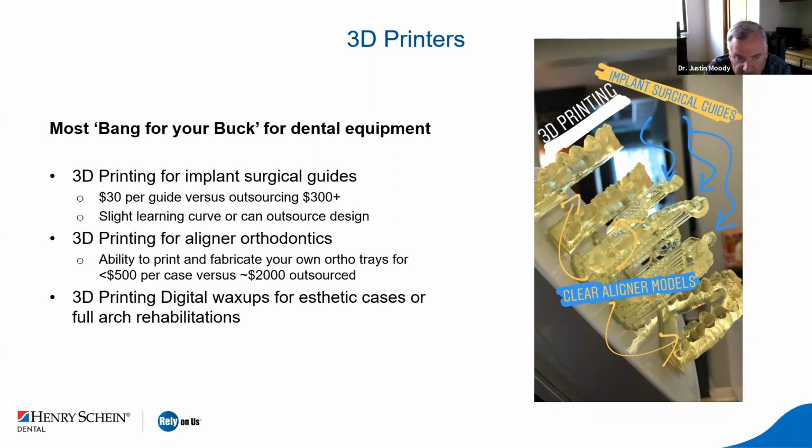And then we can use software to create our wax ups, and then we can print them so that we can show our patients what the wax up is going to look like. We don't have to wait for it to come back from a laboratory, or see, if they send it back to us in wax and it breaks, like all those things that I spent most of my career coming up against. So those are things in the 3D printing world.